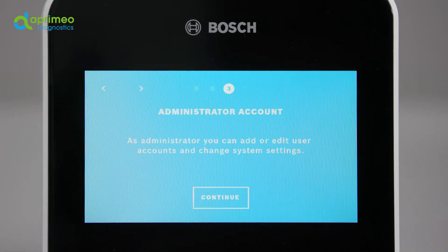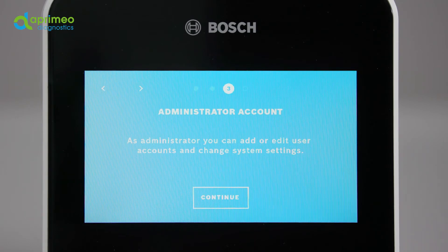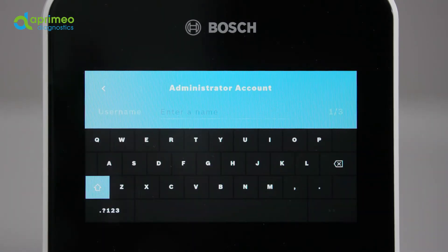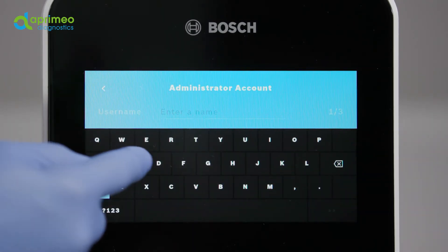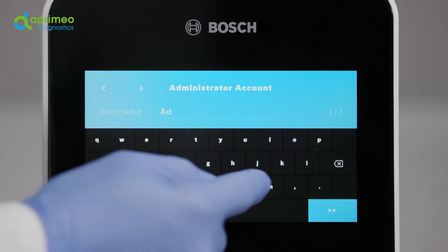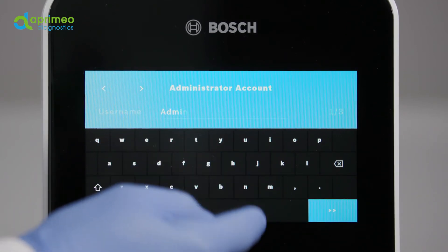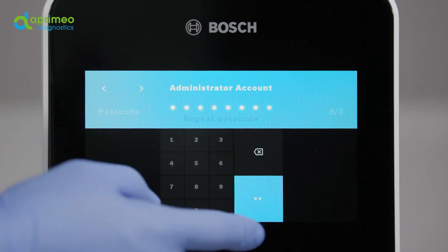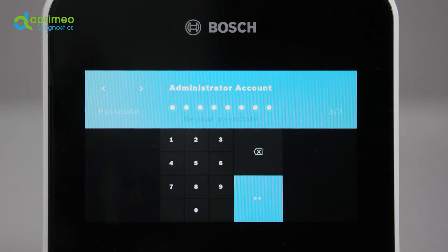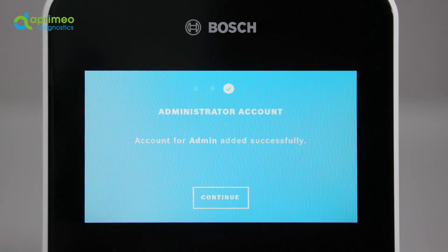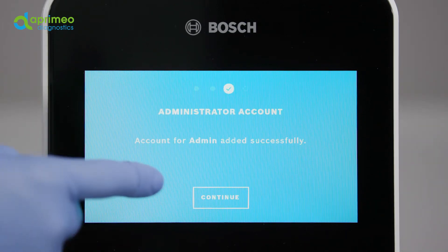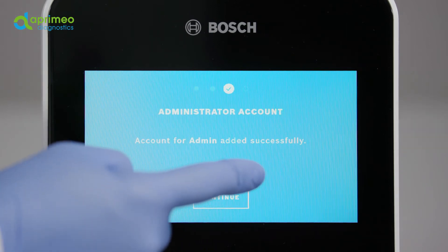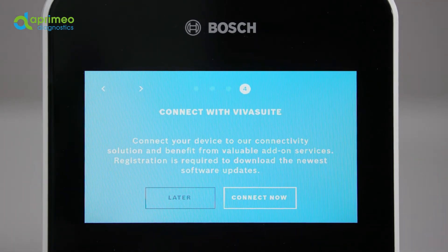Create an administrator account with a password of at least eight numeric characters. The administrator possesses comprehensive rights. Only the administrator can create or delete, activate or deactivate additional accounts over and above normal usage, connect the system to a network and configure it accordingly. Press continue in order to complete the configuration.